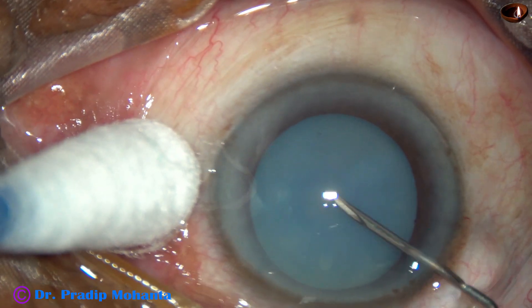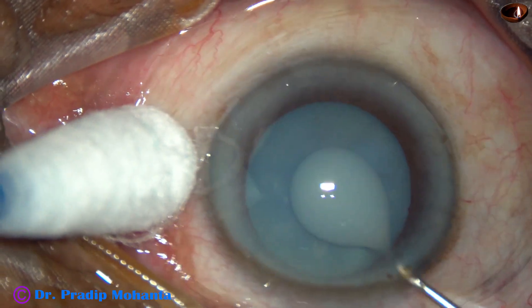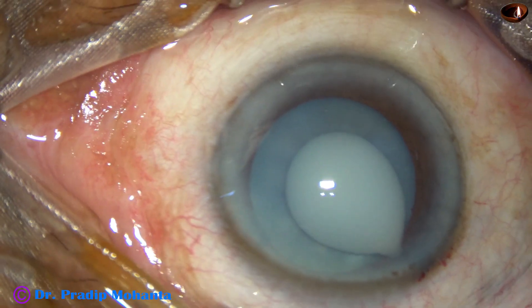This is a hypermature morgagnian cataract with a very hard nucleus. Let us see how I managed this case.